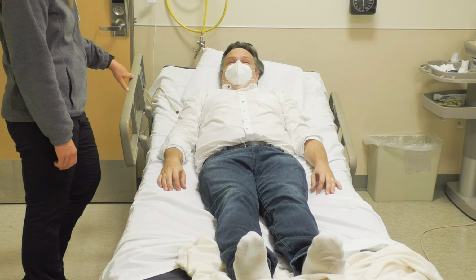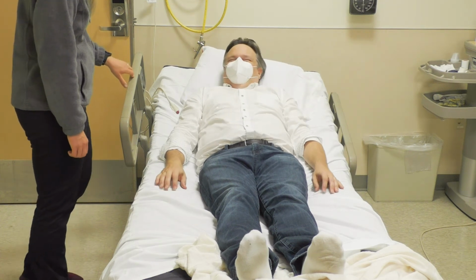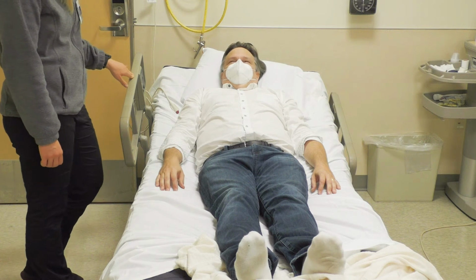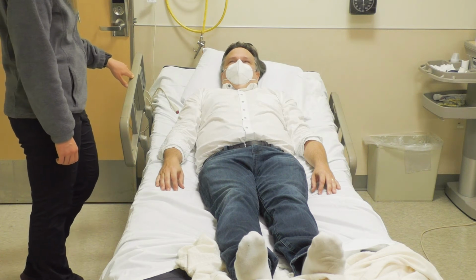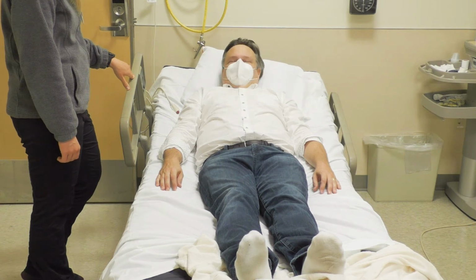Observe and note level of consciousness, pupillary size, any abnormal movements or behaviors, and describe these things out loud. Include any autonomic signs. So you kind of get the idea. You're going to be testing a lot, and again, remember to say everything out loud.